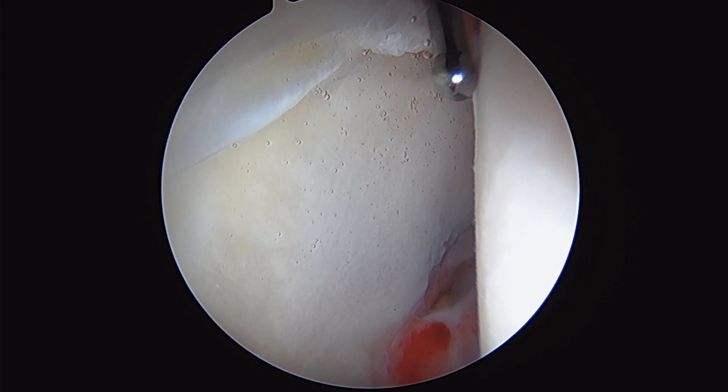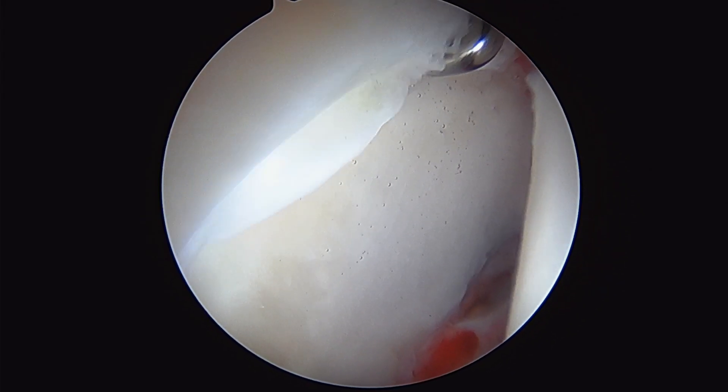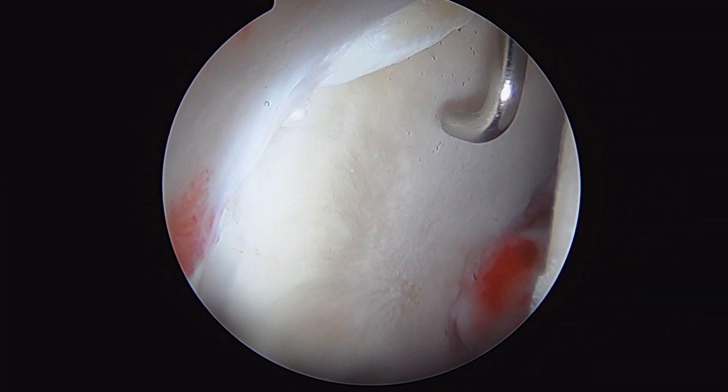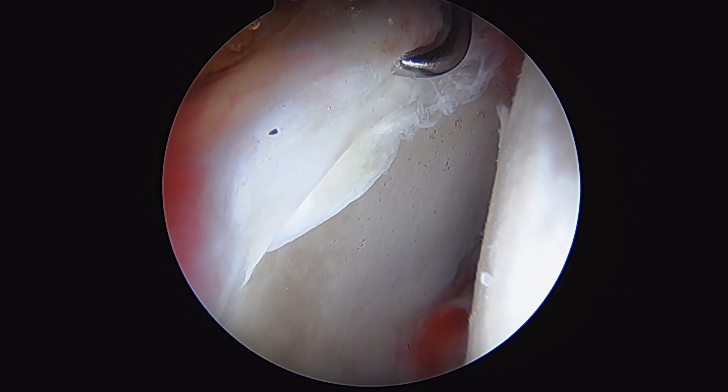We're in the right hip of an NFL football player. To the right here is the femoral head. To the left is the acetabular socket. And this is the labrum.